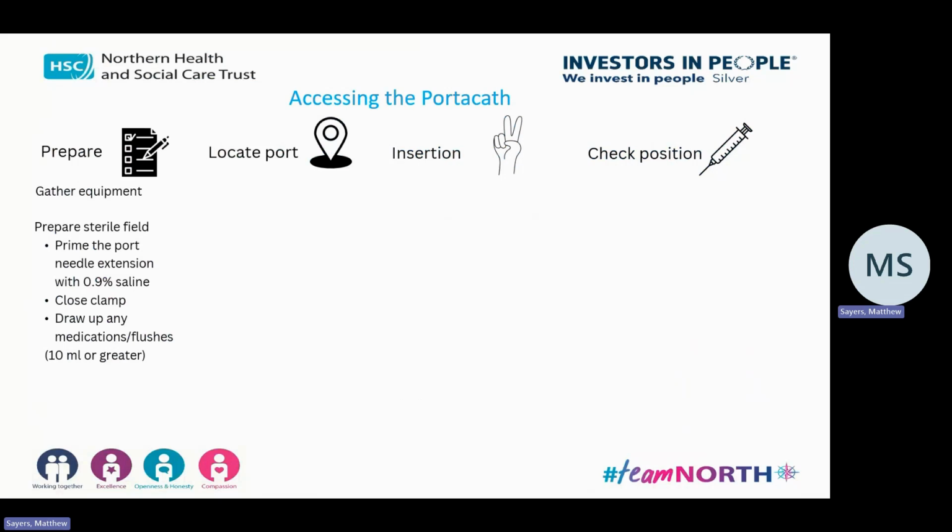And that field is kept sterile, and as Lisa's demonstrating beautifully there, you just open out everything that you'll need for the procedure onto the sterile field. It's very, very frustrating, and we've all done it, where you've got your sterile field and your gloves on, and then you've forgotten something and there's no one around to run for it. So do think about getting everything in line. You've got the second layer underneath your trolley where you can store things, but ordinarily there's probably a very helpful nurse around to be guiding you as well.